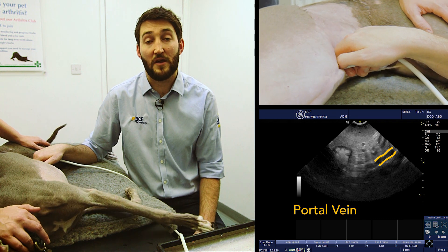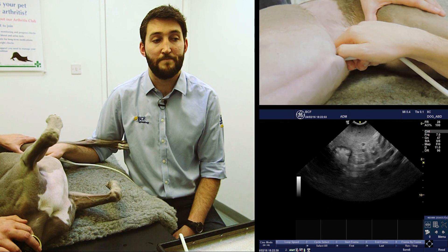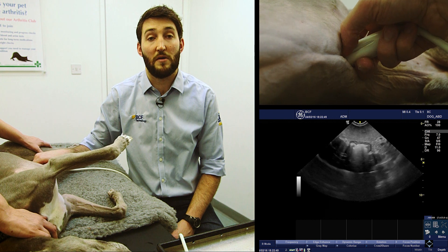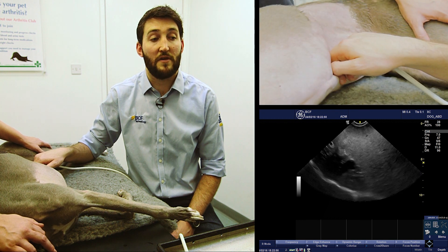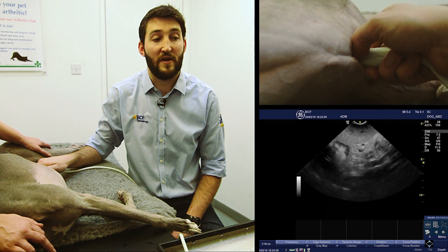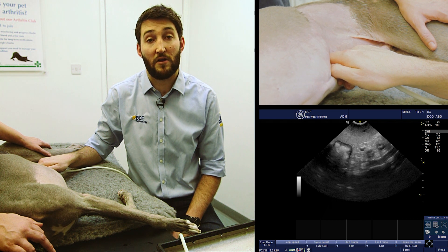Adjacent to the stomach there's a region of tissue, roughly triangular in cross-section and of almost identical echogenicity to the surrounding mesentery — that's the body of the pancreas in cross-section. On this image you can't make that out particularly distinctly, and that's fine; that counts as ultrasonographically normal, bearing in mind the caveat that it does not necessarily mean disease-free. To recap: take a sagittal view of the stomach, fan down until it disappears, fan back up slowly until the pylorus appears, swing the pylorus slightly left, continue fanning up until the portal vein peeps into the image, then look at about four o'clock off the stomach — that's the body of the pancreas in cross-section.